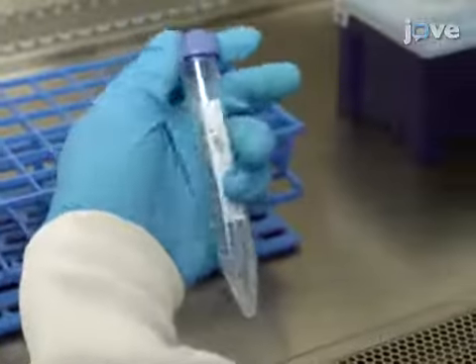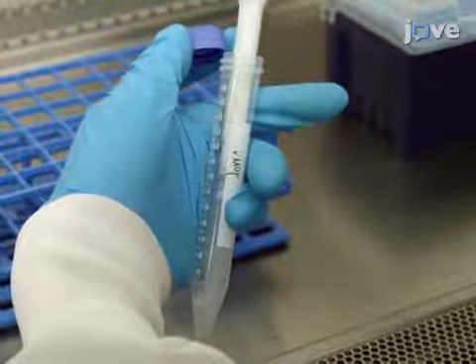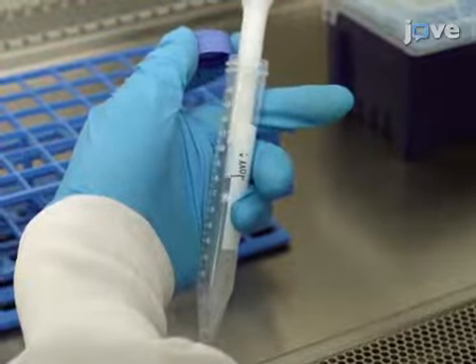Resuspend the otospheres by adding 0.5 milliliters of previously prepared, pre-warmed 1 millimolar EDTA in Hanks balanced salt solution, or HBSS, and then pipetting up and down 2 to 3 times.